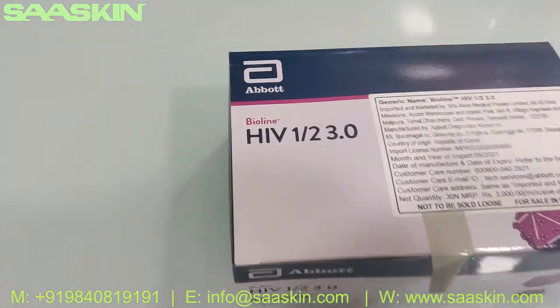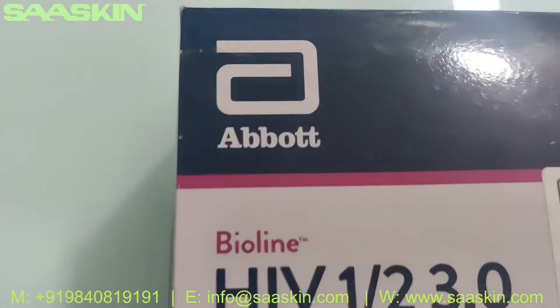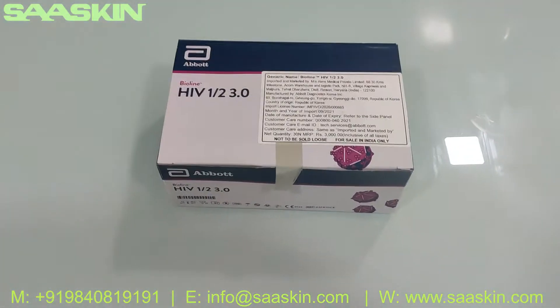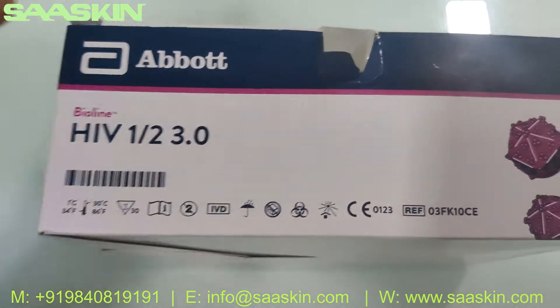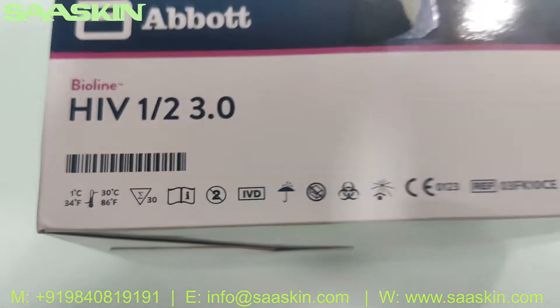Hello everybody. Today we are going to see the unboxing of Abbott Bioline HIV-1 and HIV-2 antibody test kit — a third generation antibody test kit for detecting antibodies for HIV-1 and HIV-2. This is a complete CE-IVD certified product and it is a 30 test kit box.